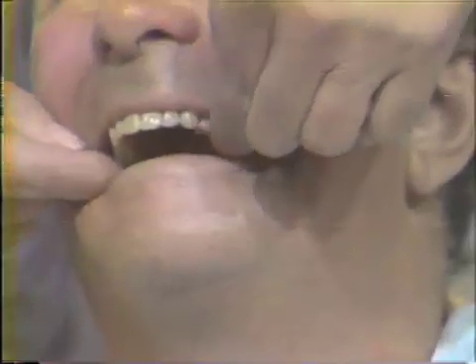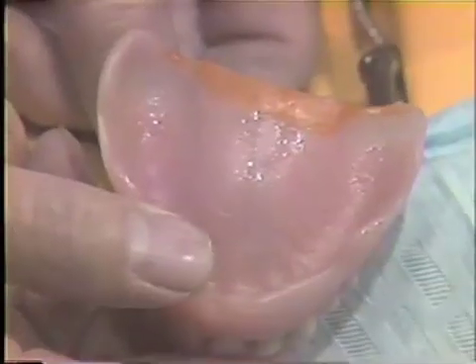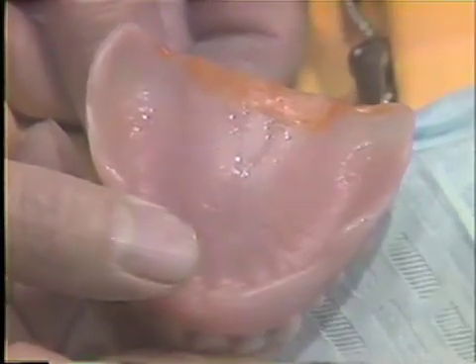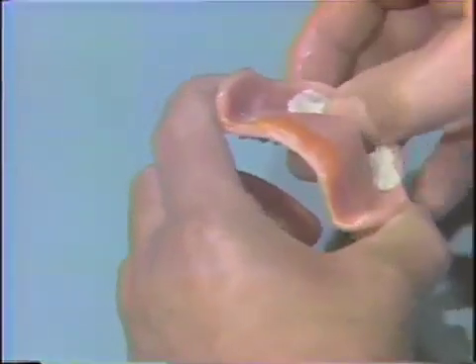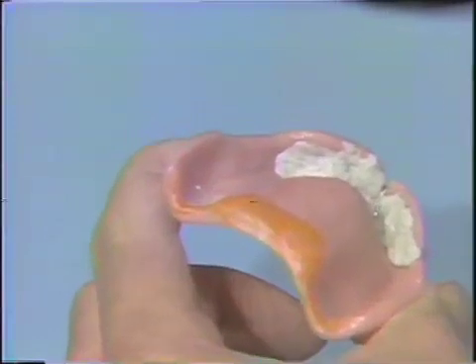is applied unilaterally in the maxillary first bicuspid region. The next step is to use wet asbestos to block out all undercuts in the anterior residual ridge area and posterior in the tuberosity area.